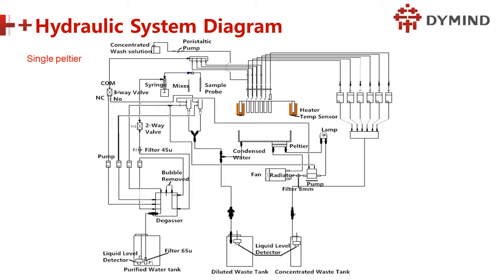Now the two wells we already introduced, and here the syringe we also introduced. Next, here I have one question: why do we need pure water to the diluent? Because sometimes we also need to dilute the sample, right? So we will take some pure water to here and inside it here to dilute and then mix again. So we also need this two-way valve to do the diluting.